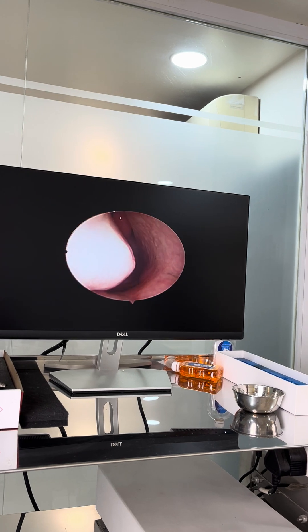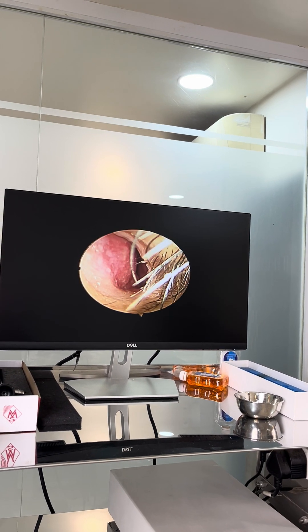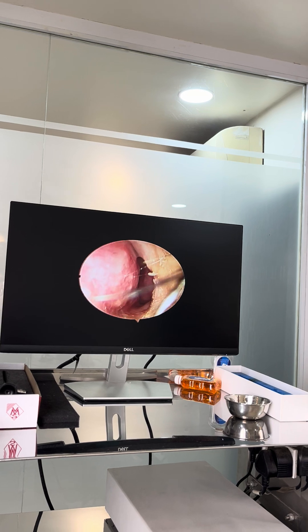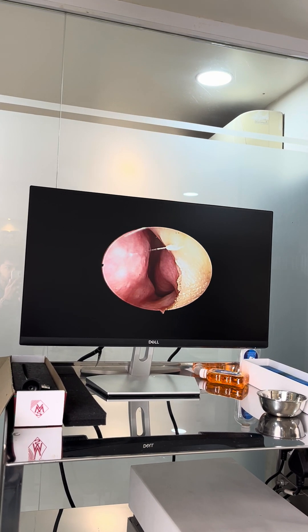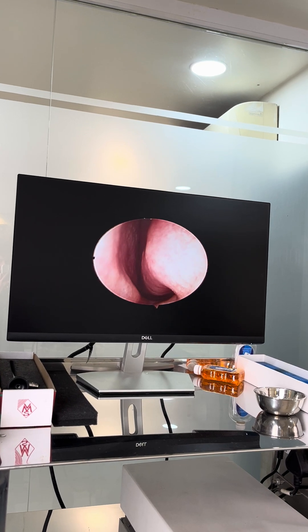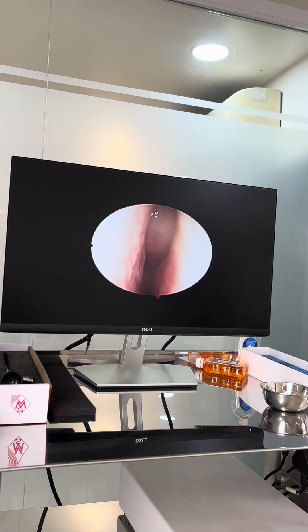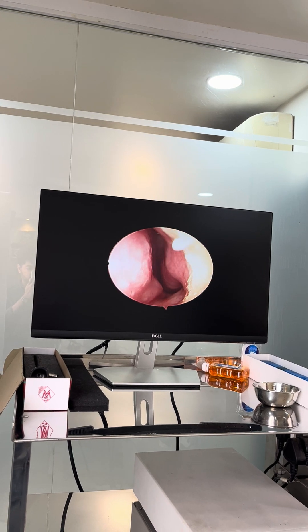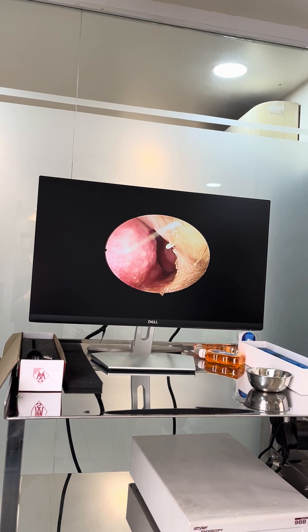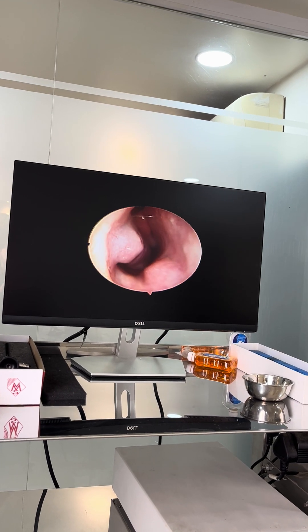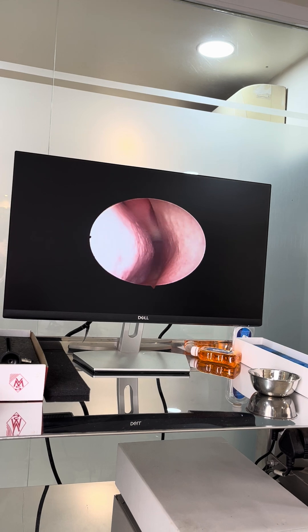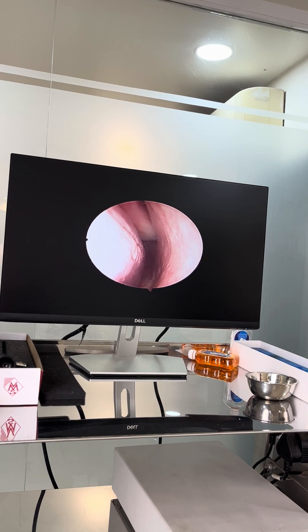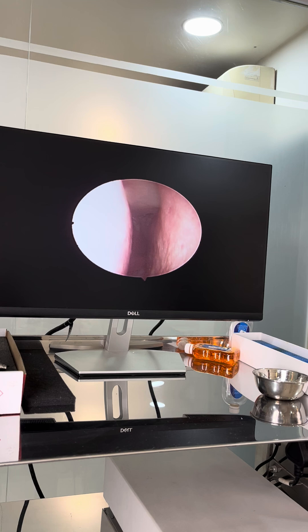Now we can come out and go to the other side. Compared to the first side, this side has a septal deviation — a bend when your septum is bent. Going inside, this is the inferior turbinate and this is the middle turbinate. There is a lot of deviation, and that's how the nasal septum and the inner side of the nasal cavity look at the back end of the nose.